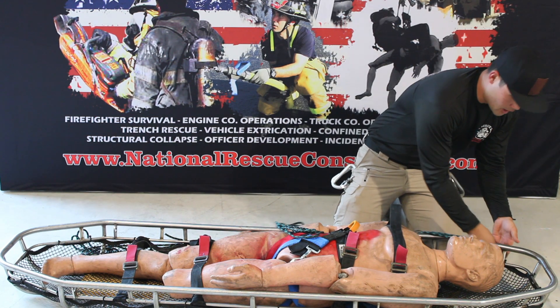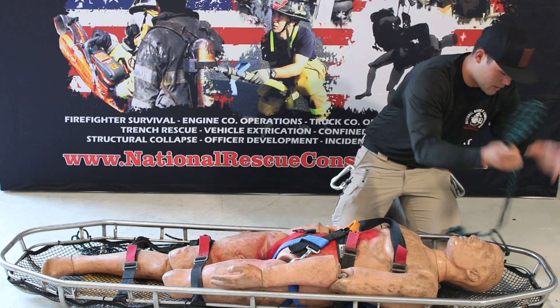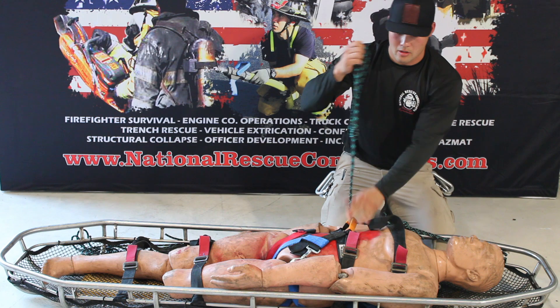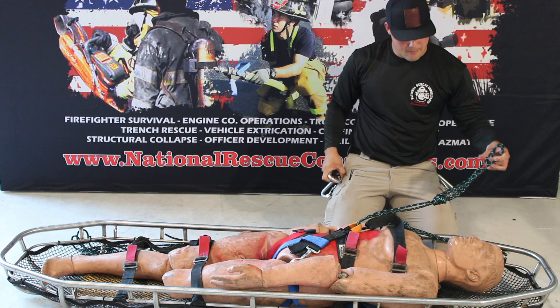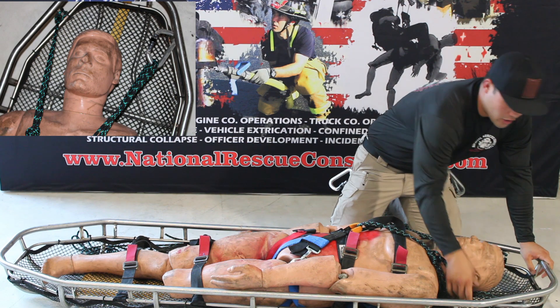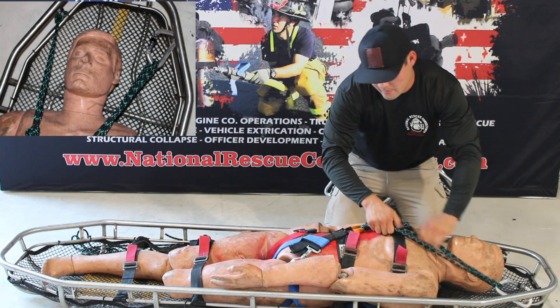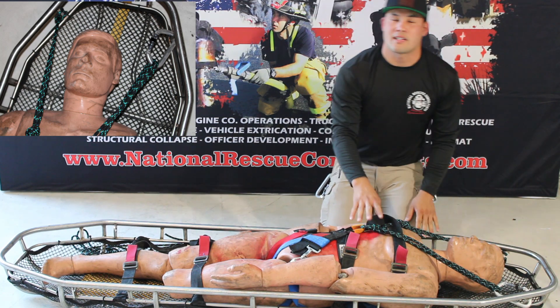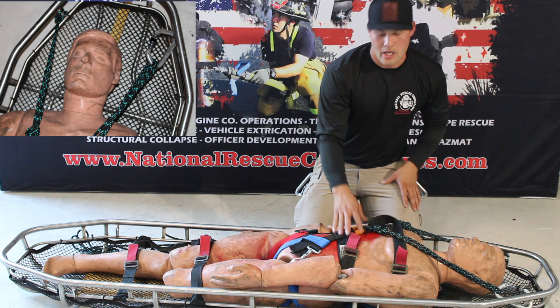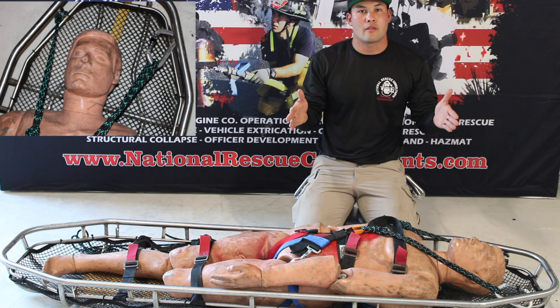First thing we're going to do, we're going to come up here and wrap a vertical post of our stokes basket — we're going to girth it. Come back down through our loop in our victim strap, pick up the harness. We're going to come back, grab another vertical post, put it in a carabiner, and tighten up. The reason we do the top first is because when this basket goes from horizontal to vertical, we don't want it to load the side at all. These are going to counteract each other and keep that load locked right in the middle of our stokes basket.